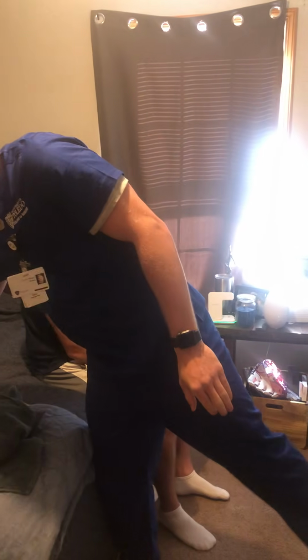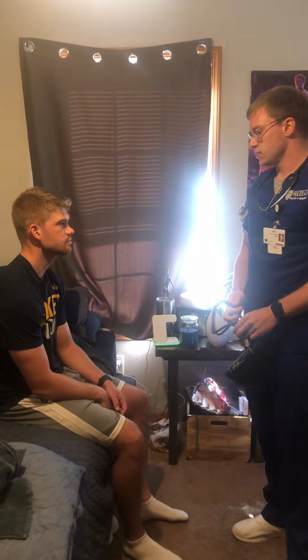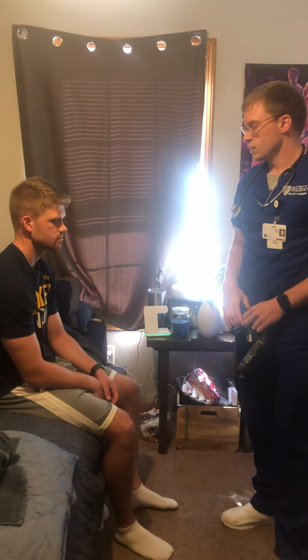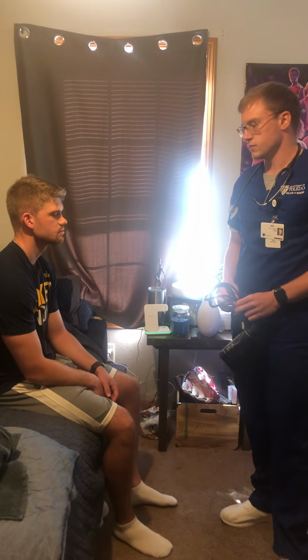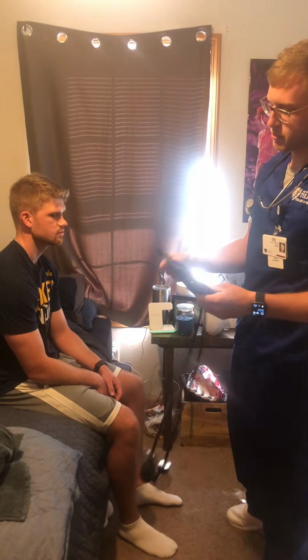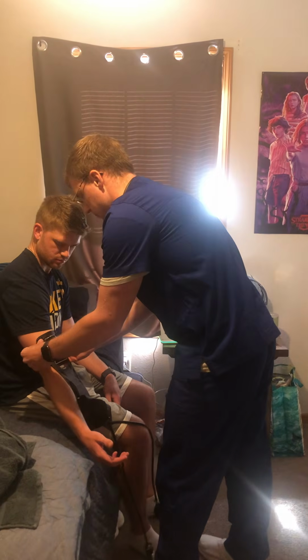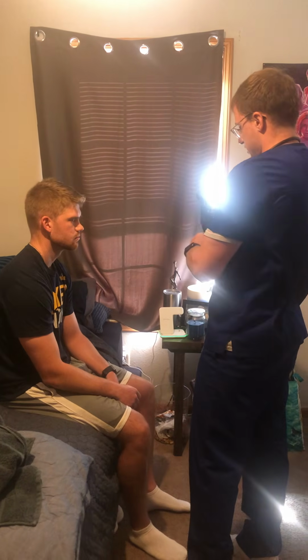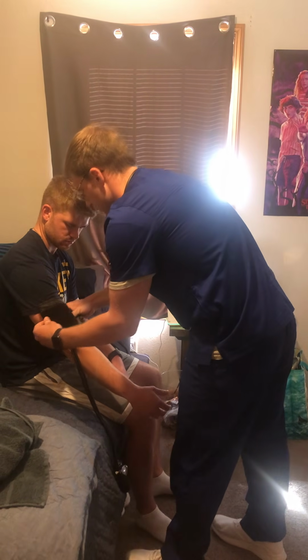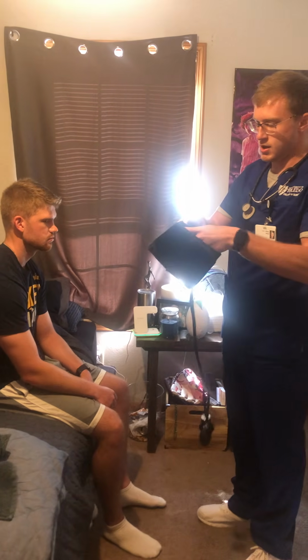And the first thing I want to make sure I note is if we have any contraindications on the arm that I'm going to take it on. So I'm going to be taking it on Braden's right arm, so he doesn't have any IVs on this arm or anything else that would prevent us from taking it on this arm. So the next thing I'm going to do is go ahead and measure the blood pressure cuff, make sure it's the right size. So the width should take up about 40% of the arm, which it does, and the bladder should take up about 80% of the arm, which it also does. So this blood pressure cuff is the correct size for our patient.